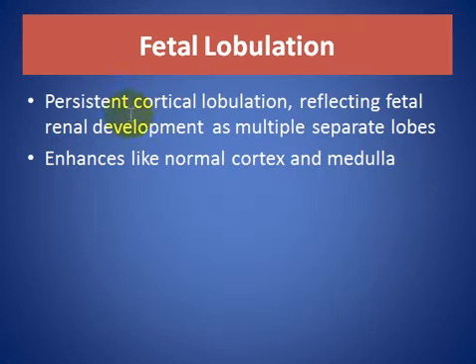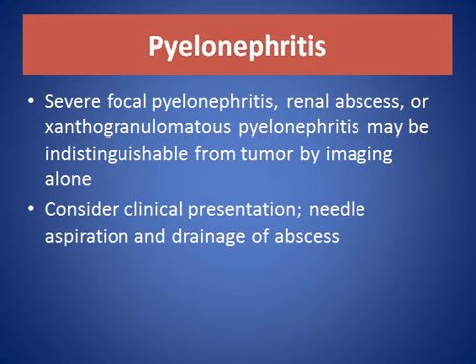Fetal lobulation, persistent cortical lobulation reflecting fetal renal development as multiple separate lobes, enhances like normal cortex and medulla. Pyelonephritis, severe focal pyelonephritis, renal abscess or xanthogranulomatous pyelonephritis may be indistinguishable from a tumor by imaging alone. Consider the clinical presentation, needle aspiration, and drainage of the abscess.